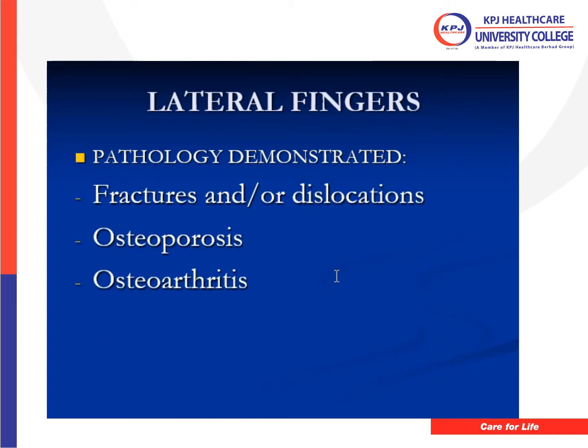Okay, go for the lateral fingers. Pathology is about the same. You can always, because a basic position is always AP and lateral, PA and oblique, PA and lateral, right?